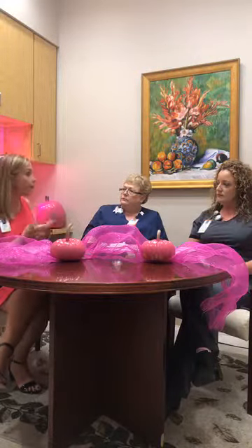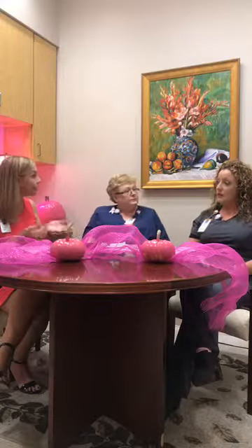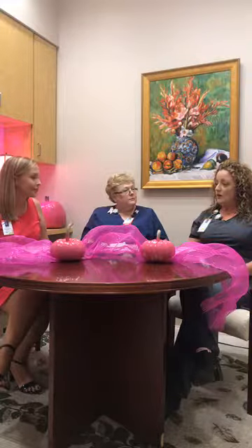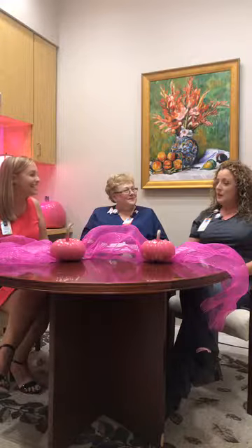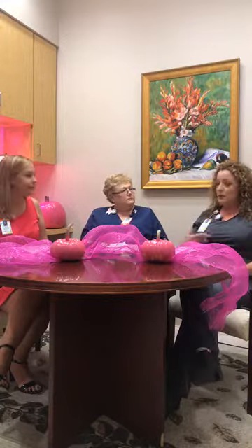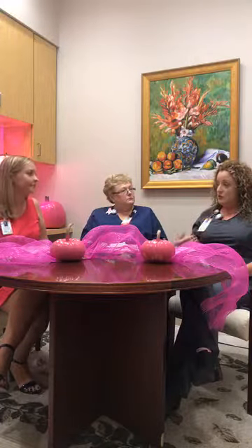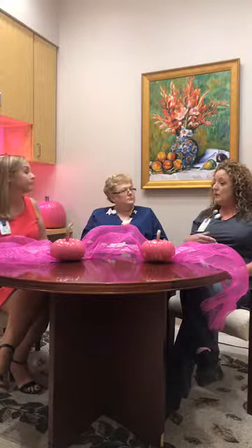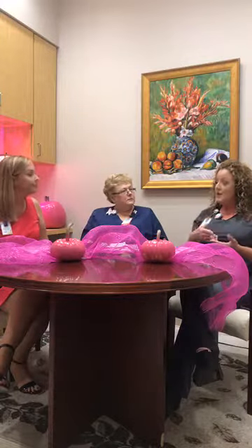When a patient comes in for their mammogram, is there something that you would recommend that they wear the day of to make the process a little bit easier? Yes. I would wear something that I could undress from the waist up. We all tend to dress up a little bit to go to the doctor, but if you come in with a dress on, you're going to have to undress completely because everything has to come off your chest. So if I was going in for my mammogram, I would wear a skirt or pants so that I could just remove my top. Also, it's very important that you don't wear deodorant and you don't wear any talcum powders or lotions underneath your breast, because sometimes those things can show up and cause a false reading. You can end up with what will look like calcifications, but it'll be your deodorant.